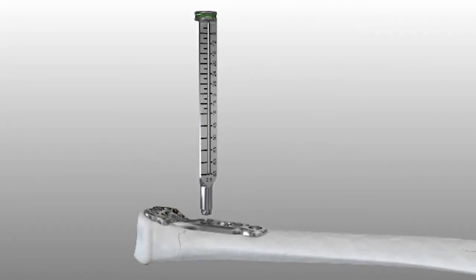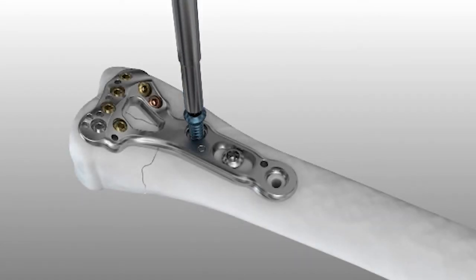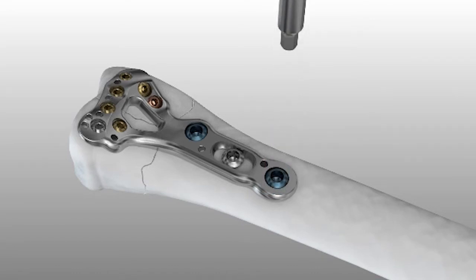Insert the threaded drill guide, drill with a 2.8 mm drill, and measure off of the laser line on the drill or with the depth gauge. Insert the proper length 3.5 mm locking screw using the 2.5 mm driver tip, screw sleeve, and blue driver handle, taking care that the screw does not exit the bone dorsally. Using the same process, place the final locking screw.